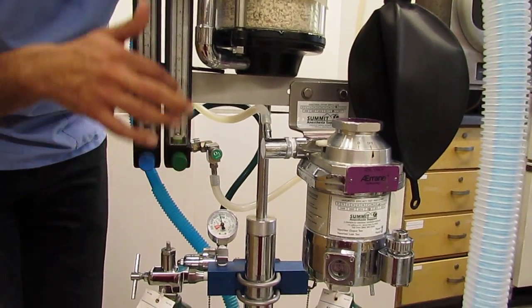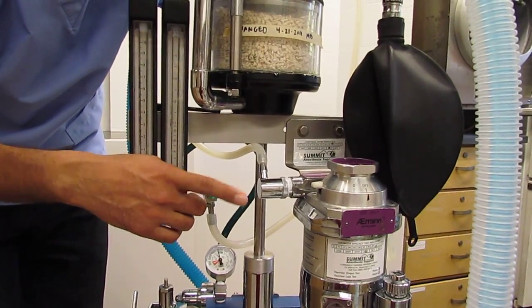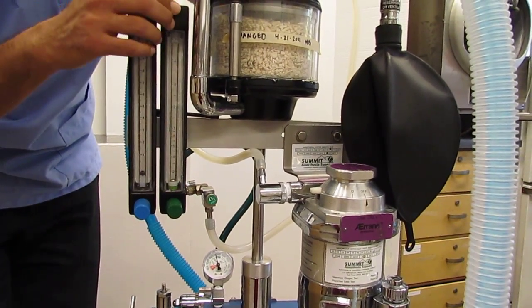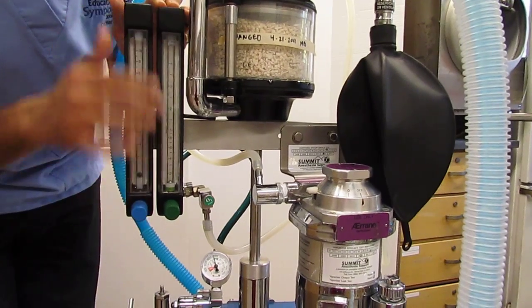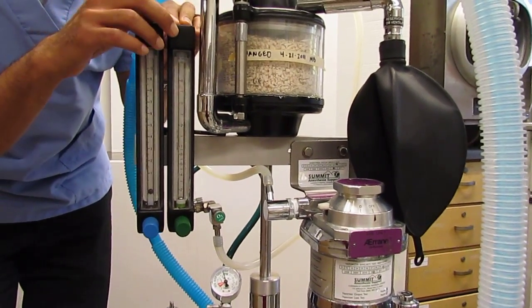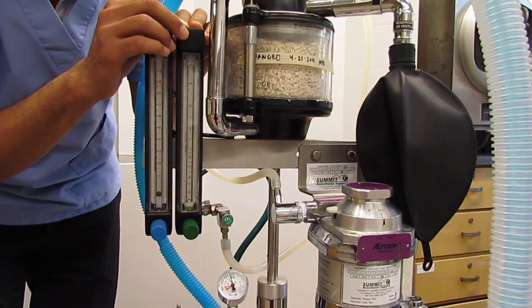If I continue through my flow meter, and we'll talk about the vaporizer in a little bit, but if I continue through my flow meter, I will reduce my 50 psi oxygen down to about 12 to 15 psi, okay?